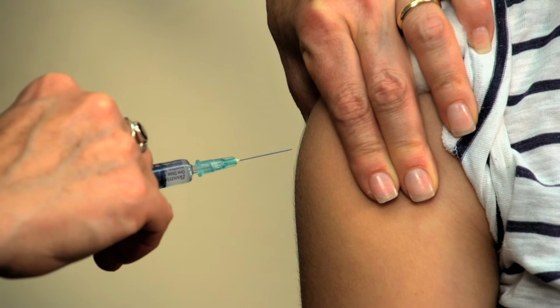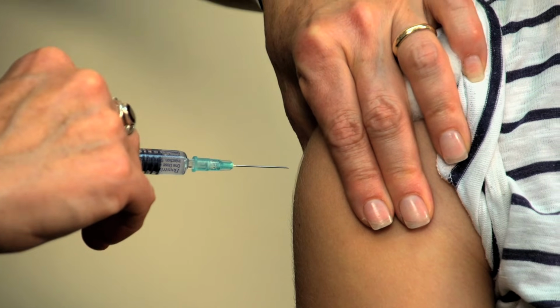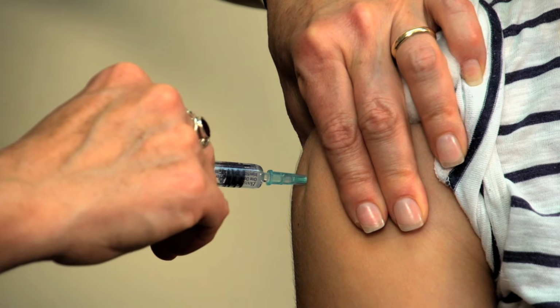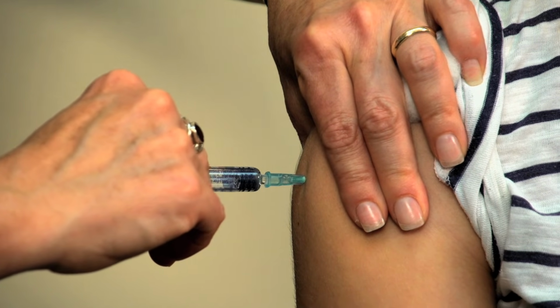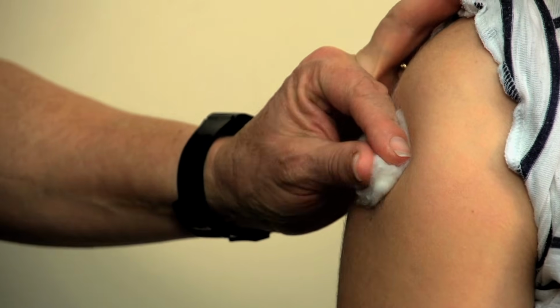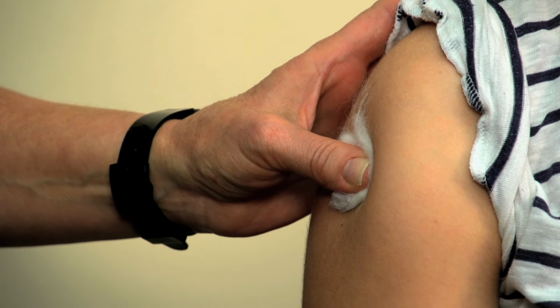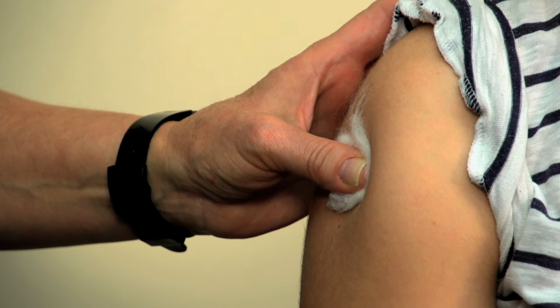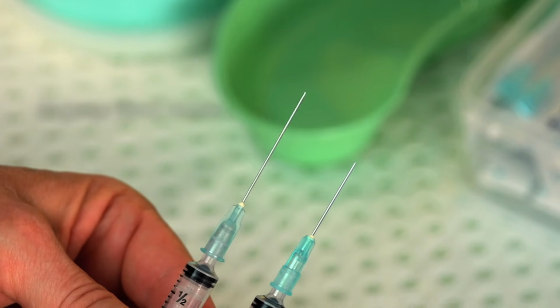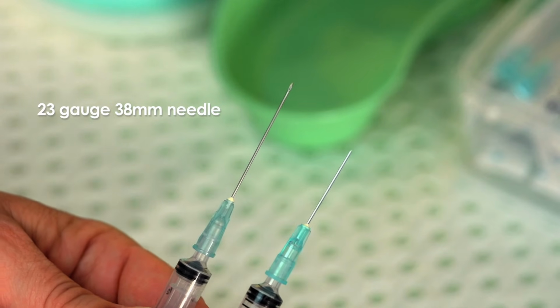Using the 23-gauge 25mm needle, you can pierce the skin at an angle of 90 degrees, safely inserting to the hub. Remember that as long as you use an injection angle of greater than 70 degrees, the needle should reach the muscle layer. You can administer a single injection into each deltoid muscle. The injection techniques for both the intramuscular and subcutaneous vaccinations in adults are the same as those demonstrated earlier on the infants and children. You may need a longer needle for the very large or obese clients, and a 23-gauge 38mm needle should be used for intramuscular vaccination.